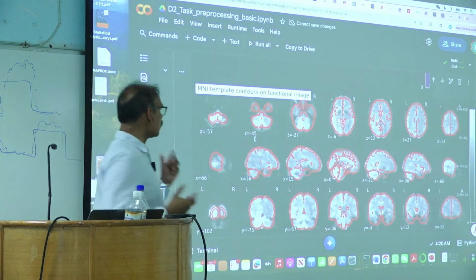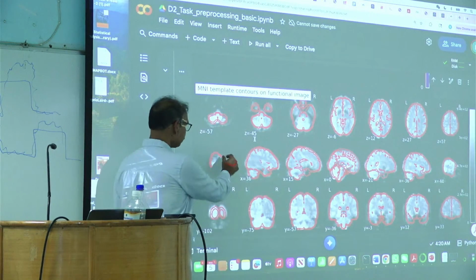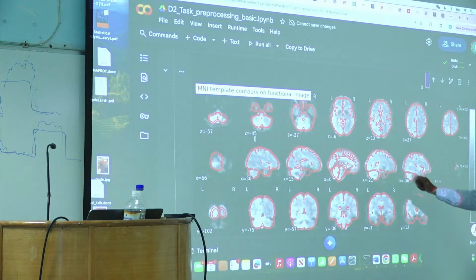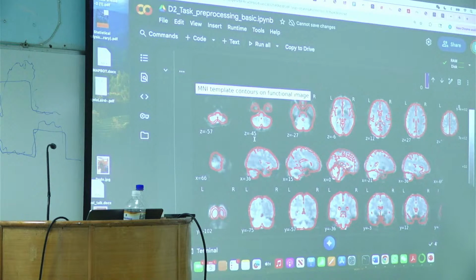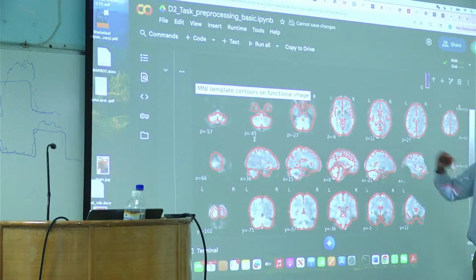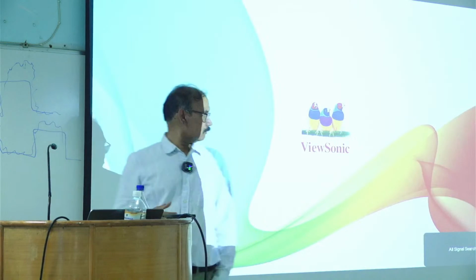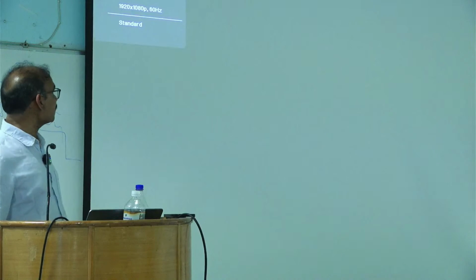So let's say you saw activation someplace like here, right? Okay, maybe, yeah, let's say something around here you saw activation. Then it's very unlikely that it would be from the subject pertaining to a specific task.